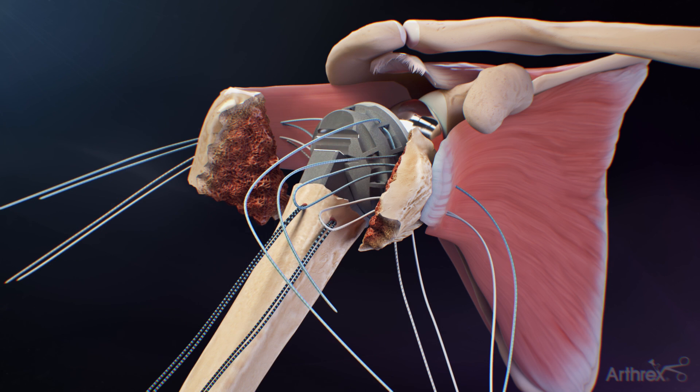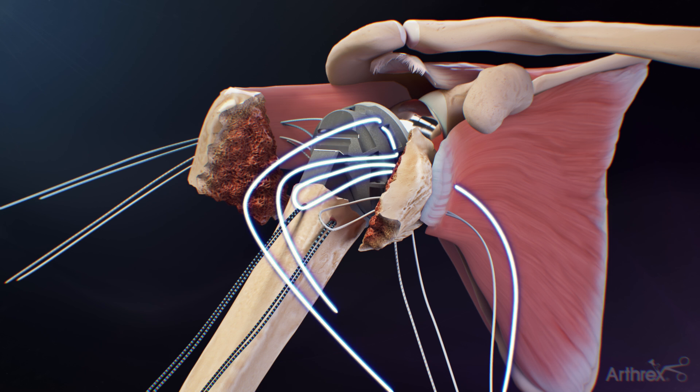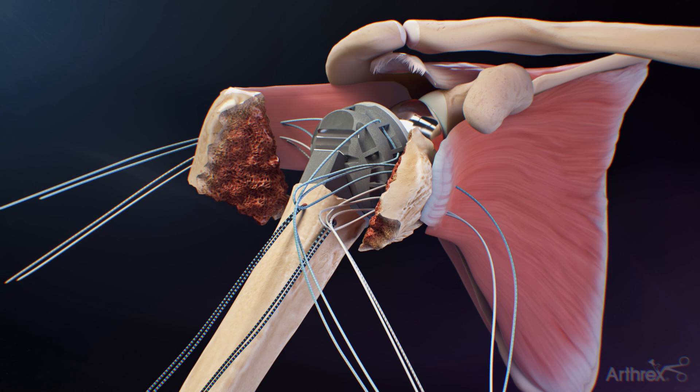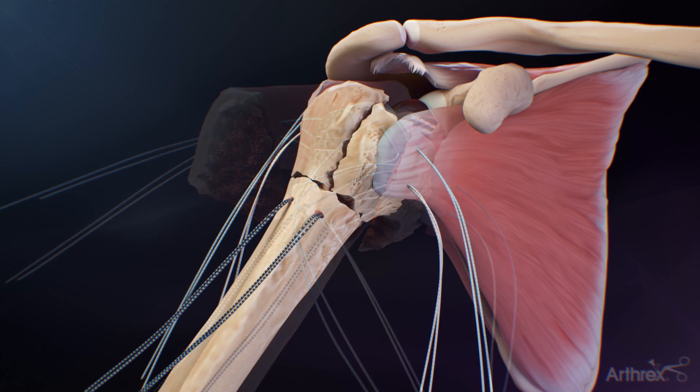Reduce the shoulder. On the anterior side, take the suture tails from the blue fiber tape and feed them into the blue fiber link looped end. Repeat the previous steps for the tiger tape and tiger link. Shuttle the suture through the subscapularis.